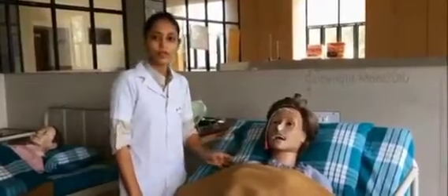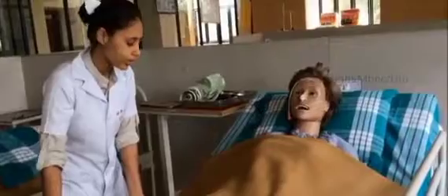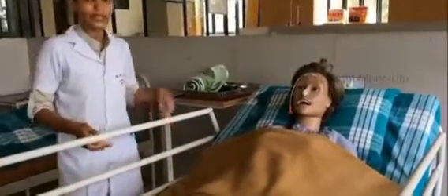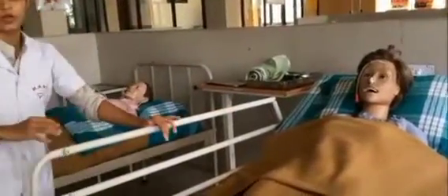After the fixation, now we will do the recording and reporting of the procedure. First we have to give proper positioning and see the patient's comfort, and if the patient is alone, we have to raise the side rail for the prevention of a fall.